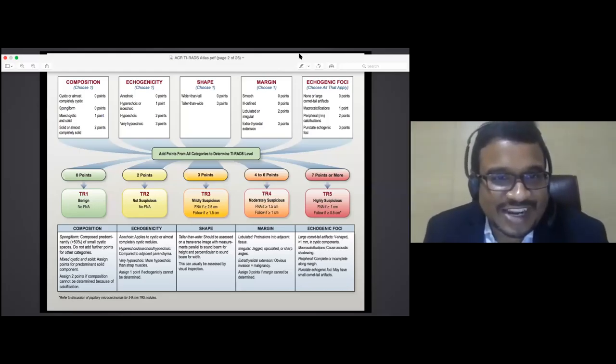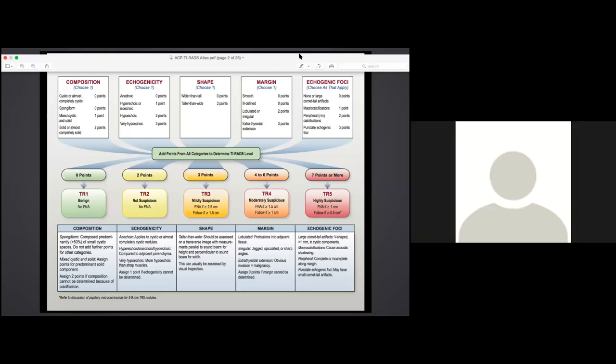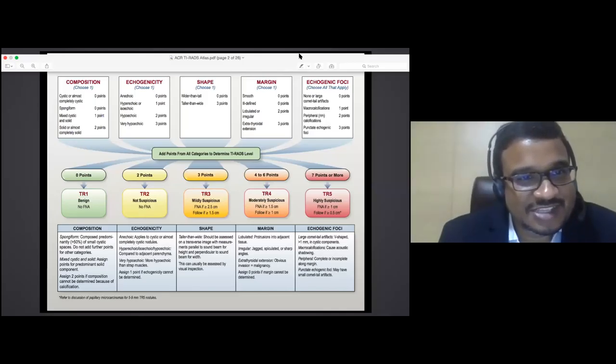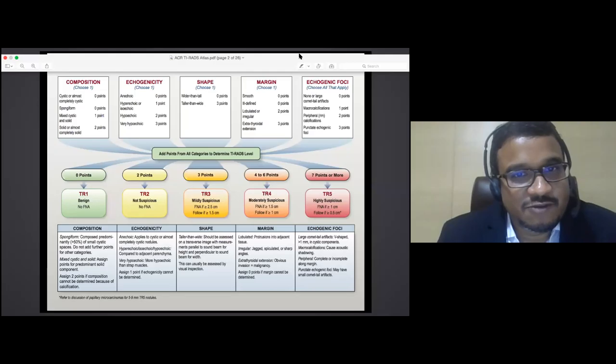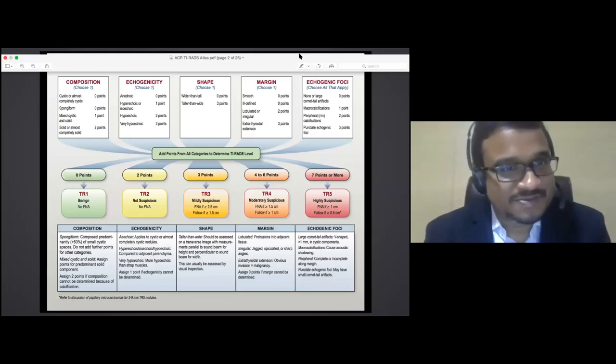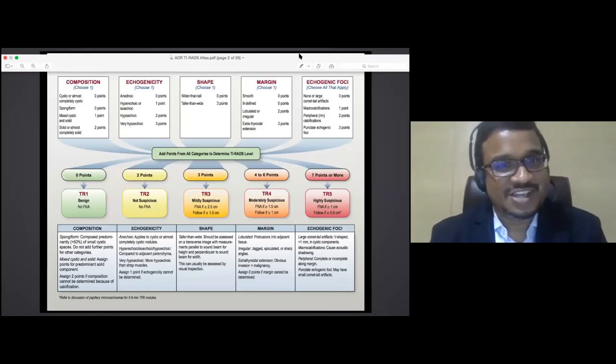Dr. Panja, would you like to add anything? No, I think she explained extremely well. We sometimes call those reflection artifacts, just like how Vrinda said, it reflects off. Okay, so there's one more question. I think Dr. Panja, you should answer this. Your views on comparison between ATA and ACR TI-RADS for choosing nodules for FNAC and which should be used.